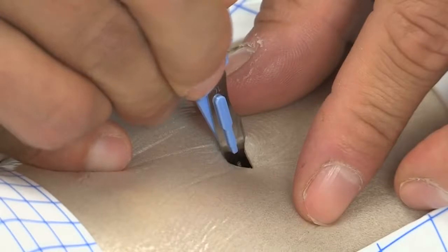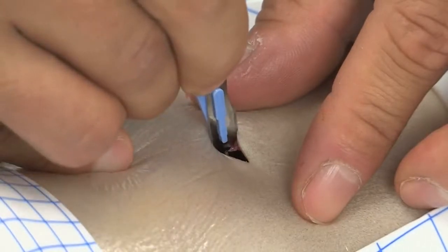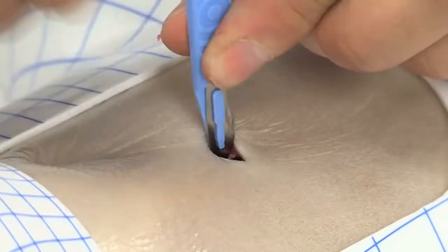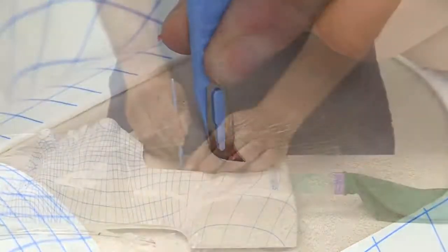While maintaining perpendicularity, the blade should be pulled towards the anesthetist, producing a triangular hole in the skin and underlying airway.